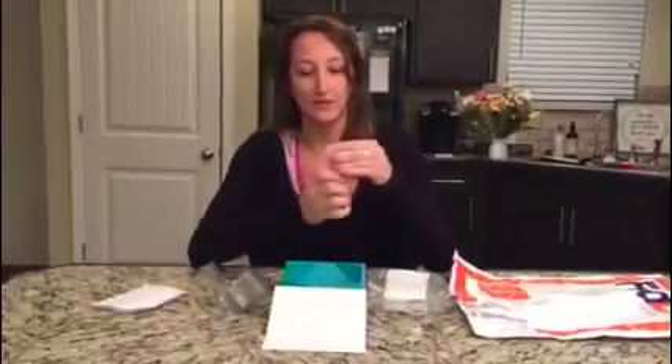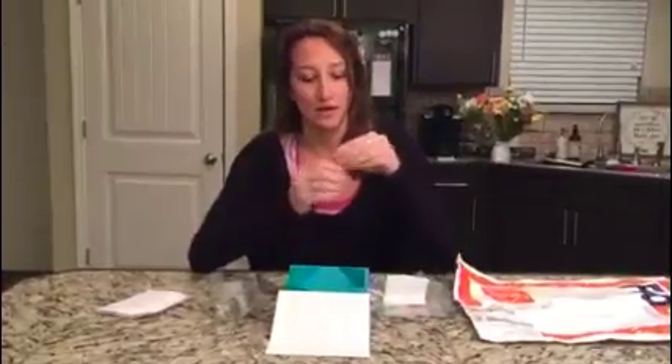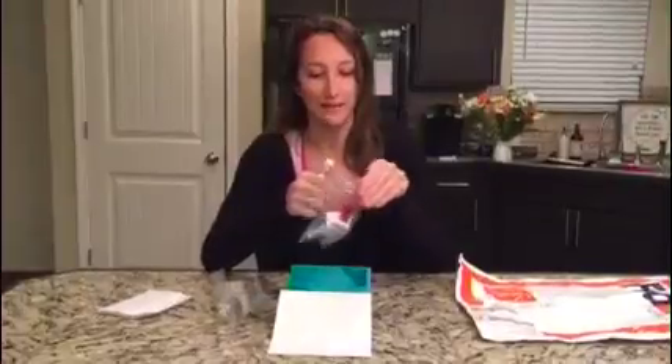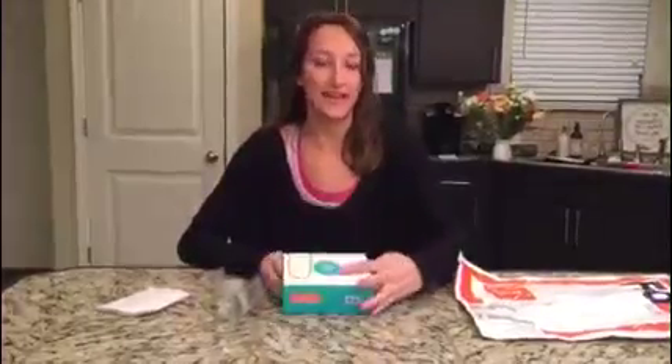When you're done, remove the top and discard it, then screw the cap on. Put it into your specimen bag, seal that, and place it right back into the box it came in. Then you're ready to put it in your FedEx bag, and you can arrange for a free pickup or go to any FedEx store. Once you've shipped your kit, you'll receive an email in four weeks or less telling you your results are ready to be discussed with a counselor.